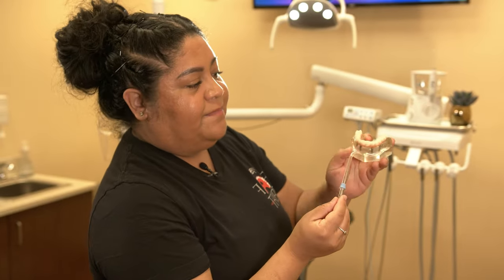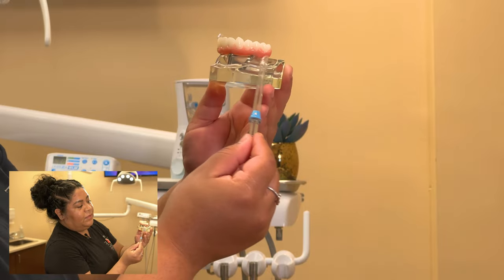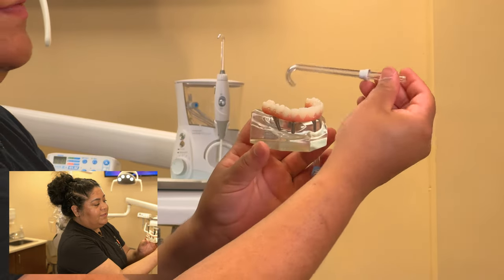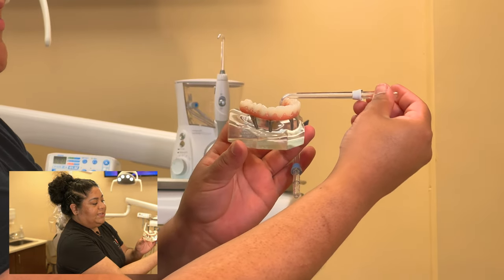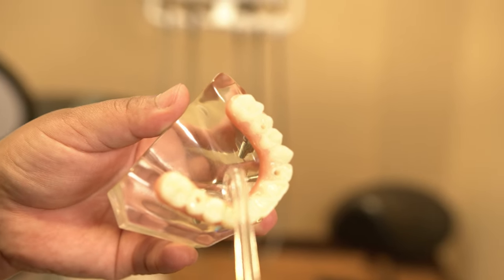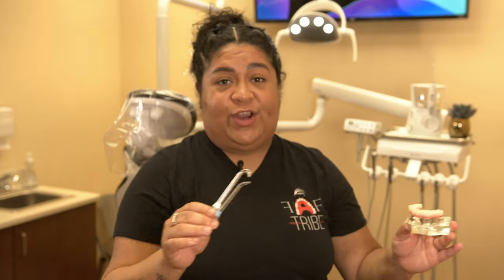The standard tip goes on the outside. Once you're done with that, switch to the curved hook tip and clean the inside — same thing, two passes around. And once we're done with that, we are completely finished.